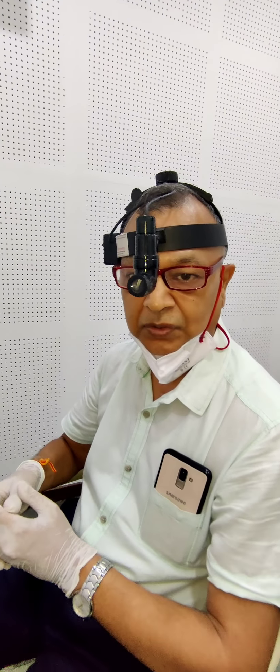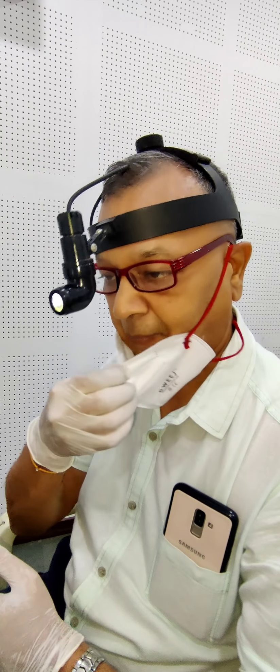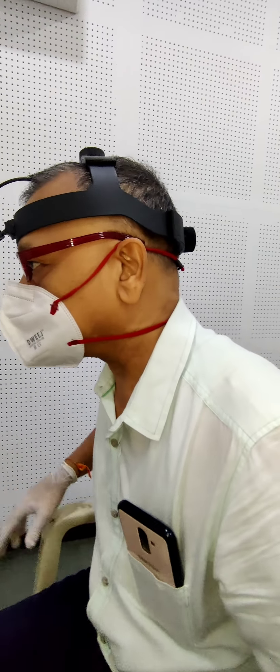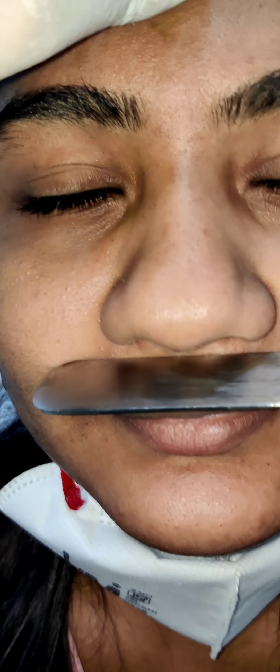Now I will show you the functional examination of the nasal cavity, how it is performed. First we will perform the spatula test. In the spatula test, we put the tongue depressor just below the nose and ask the patient to exhale. You can see this fogging, and we should compare this fogging from the left and right side. In this particular case, you can see equal fogging on both sides.